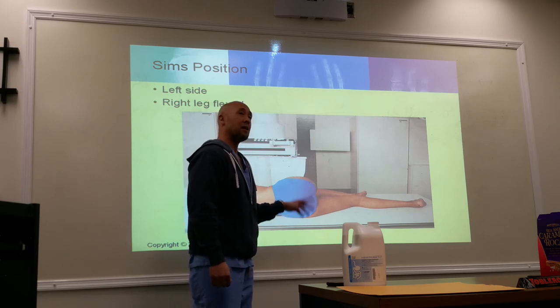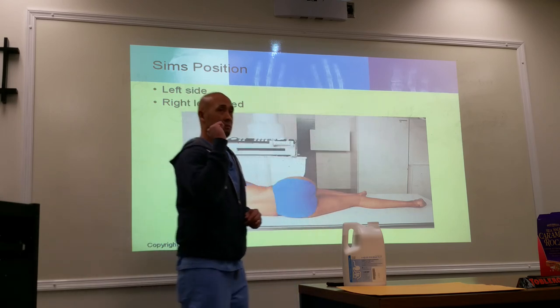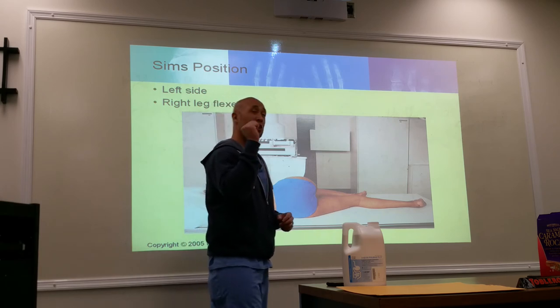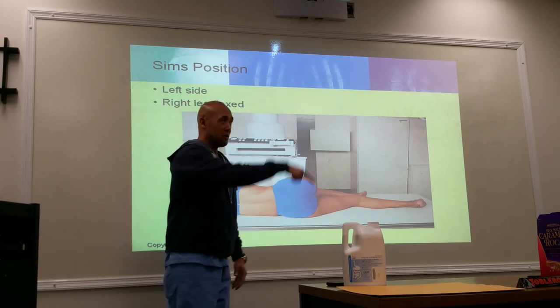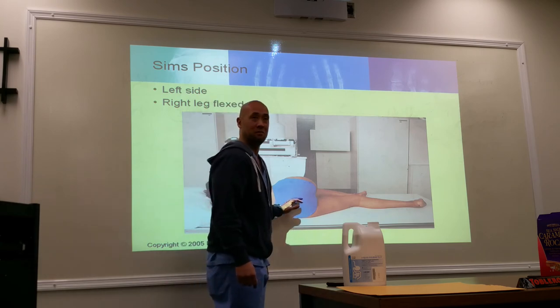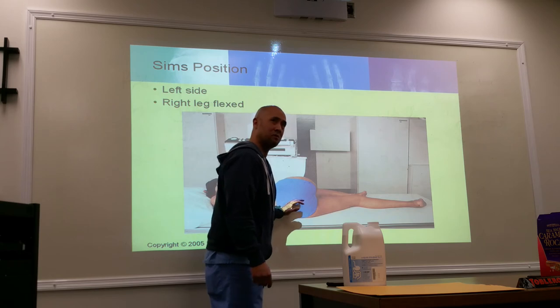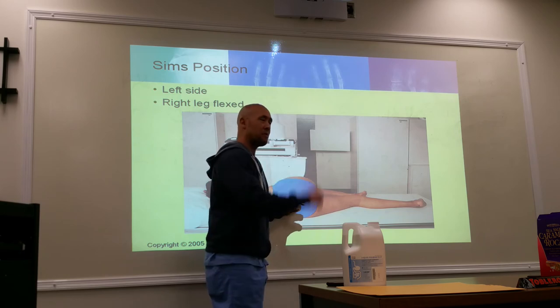So I put her on her back, and the doctor says, inflate. So I inflated. All I heard from her was a kind of strange reaction. And he goes, barium on. When I turned that barium on, she started screaming. I'm like, what the hell is wrong with you? I've done a lot of these, and it shouldn't be a problem. So the doctor said, clamp it off. I said, clamp it off.